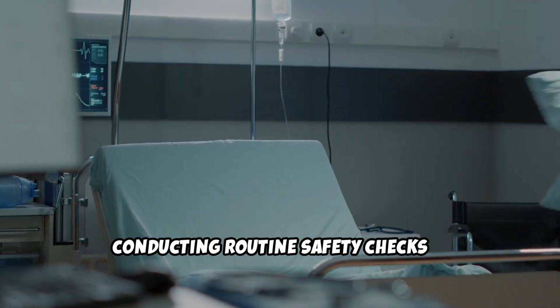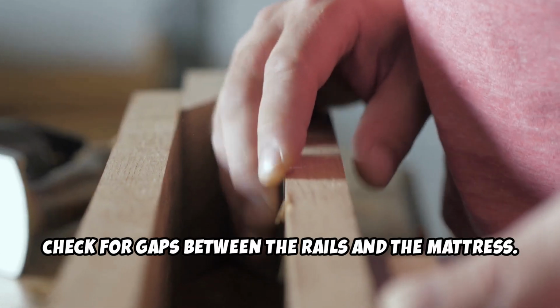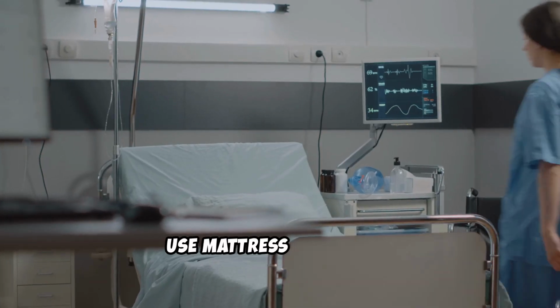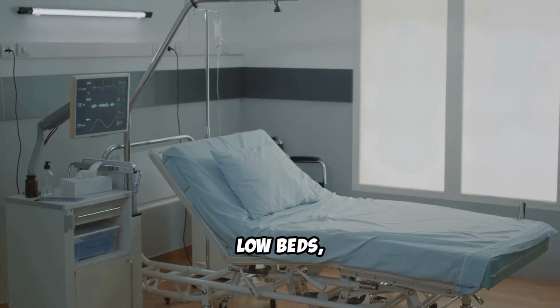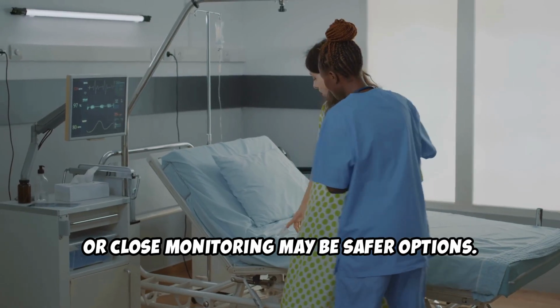Conducting routine safety checks is another key practice. Check for gaps between the rails and the mattress. Ensure that the rails are locked and secure. If needed, use mattress extenders, padding, or gap protectors. Also, consider alternatives first. Low beds, fall mats, bed alarms, or close monitoring may be safer options.